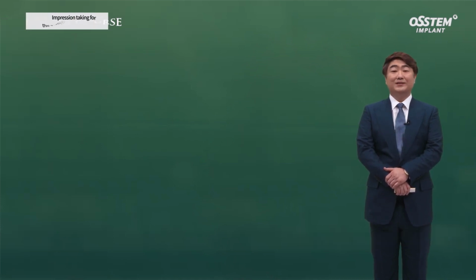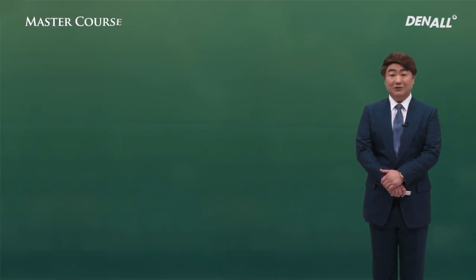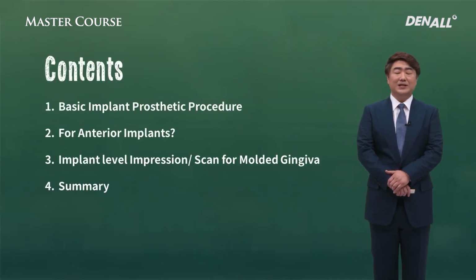Today, we're going to look at impression taking for the anterior implant prosthesis. Up to now, I talked a lot about digital technology, and today I will also explain using digital technology, or how digital technology can be used. So there are 4 areas I'm going to talk about today.